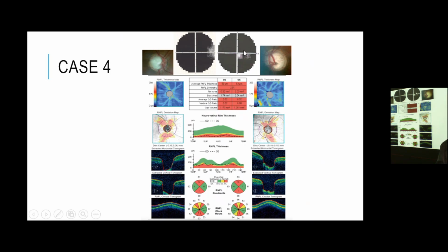Yes. And also, as you can see, the visual field shows very advanced glaucoma. You need even 10-2 for follow-up. In these cases, this is 10, this is 30. When you have severe or advanced glaucoma, as we mentioned before, the OCT is less sensitive. OCT is good in early glaucoma. When you have advanced glaucoma, it's less sensitive and the changes will be very minimal.